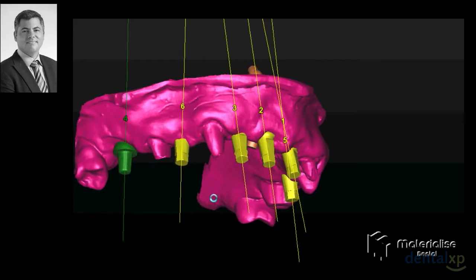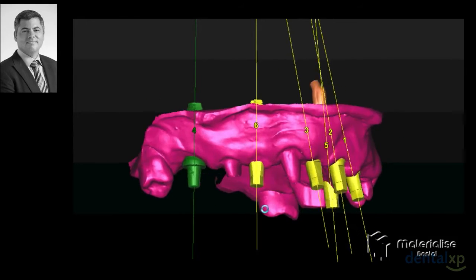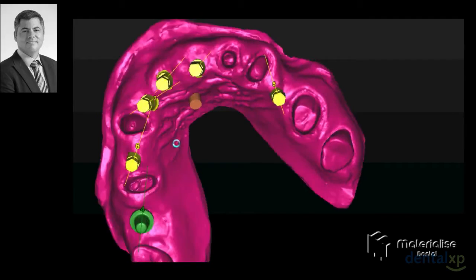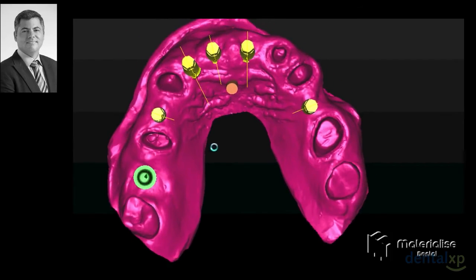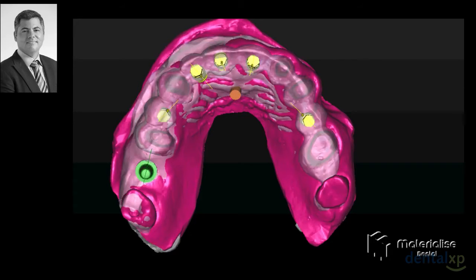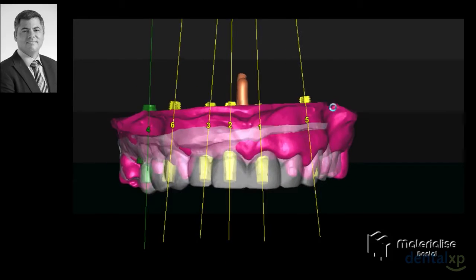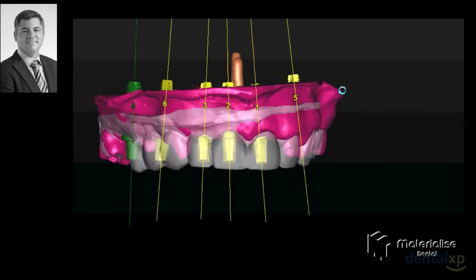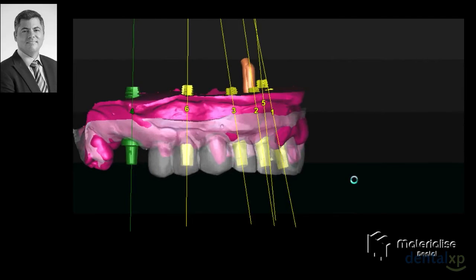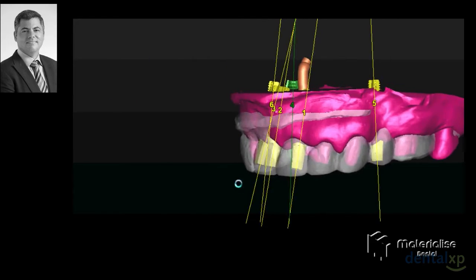What you see here is an overimposure of the implants with the optical scan of the abutments and the edentulous spaces, and you can see all the soft tissue volume, which is important information that you can now introduce into your treatment planning process. You know exactly where the nerve is located. You can overimpose the second optical model, the one of the temporary crowns. And thanks to this type of technology, you can do the best possible planning and facilitate the surgical process once you're ready to start conducting the surgery in your patient.